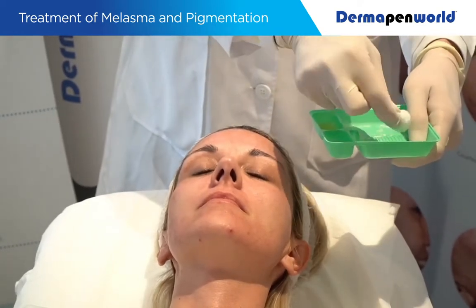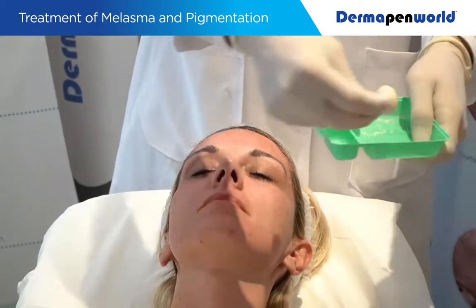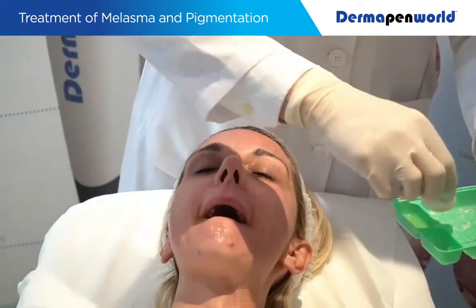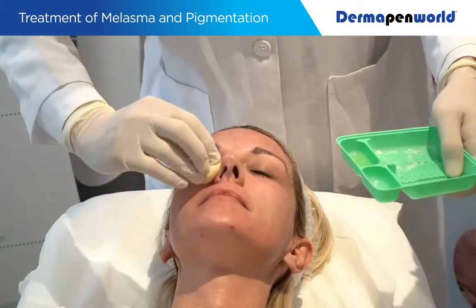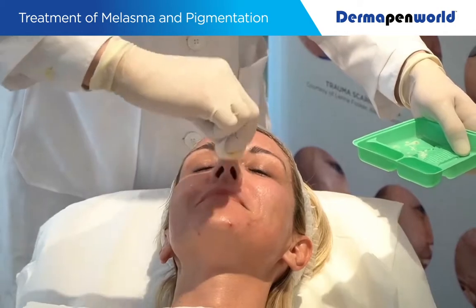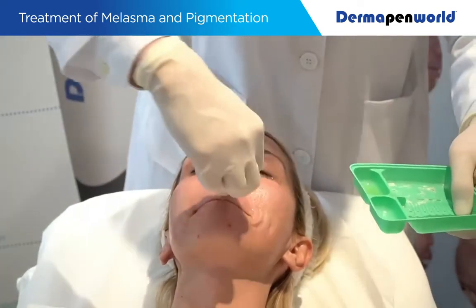It's going to feel a little bit spicy for 7 seconds. So on 7, 6, 5, 4, 3, 2, back to normal. Just tighten your bottom lip for me. Thanks. So on sting, 7, 6, 5, 4, 3, 2, back to normal. Onto the cheeks, again a little bit sharp, 7, 6, 5, 4, 3, 2, 1, and then just on the top lip. Just tighten the top lip and go like that. Done.